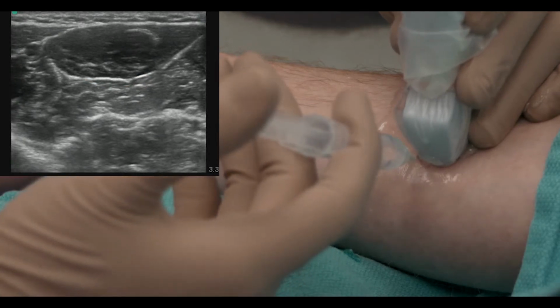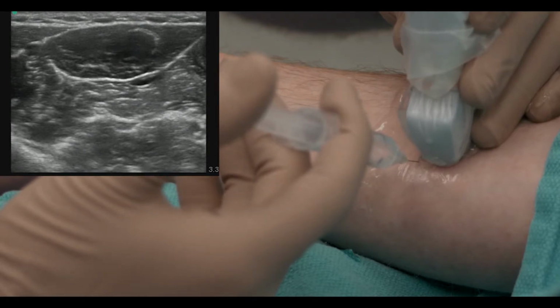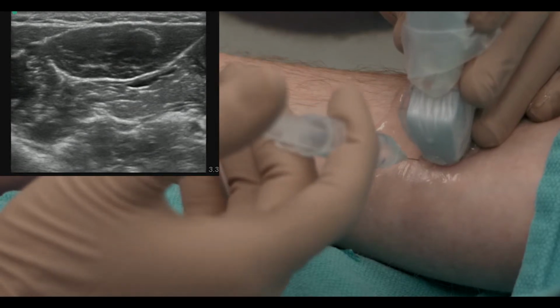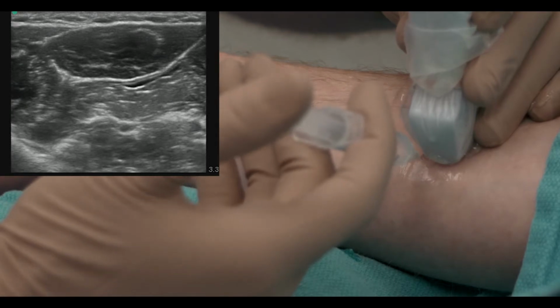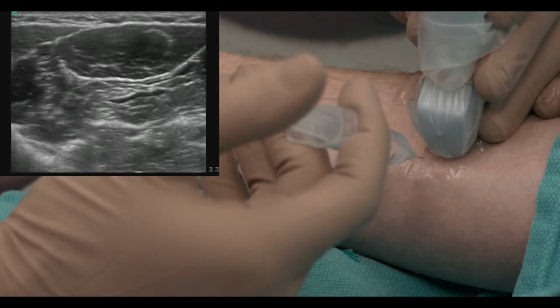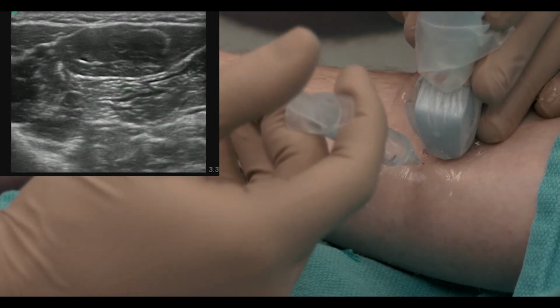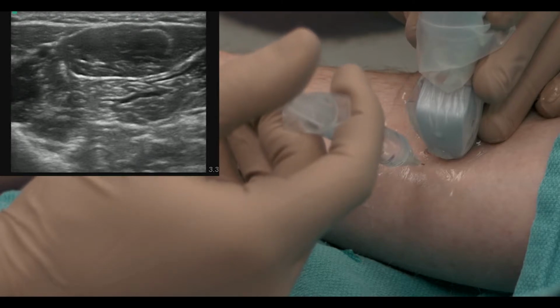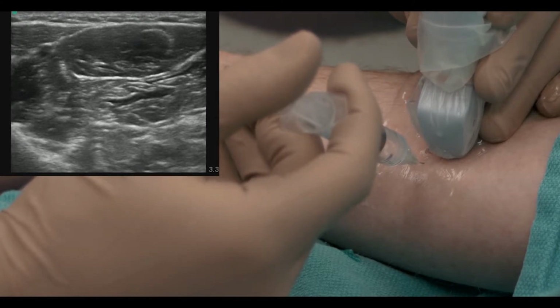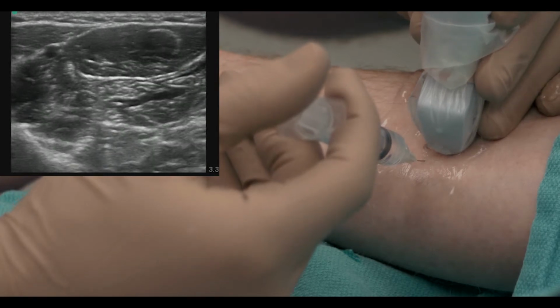Once we get below that first fascial layer, inject a little bit of freezing. We can see it dissecting along that tissue plane. We can advance a little bit farther. If we lose the tip, just slide back and forth, or just wiggle it a little bit, and then we can see where we are. There we want to fill up that entire area, and we can see the fluid coming around the nerve.